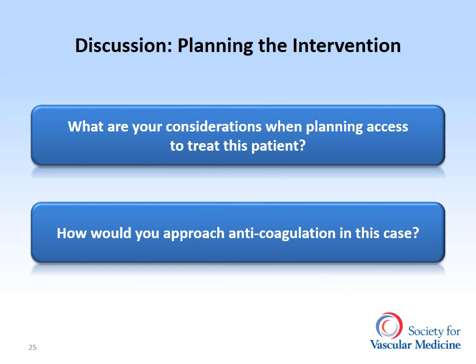There are a number of considerations regarding vascular access and anticoagulation for this patient. With respect to access, ipsilateral retrograde is one option that would provide good support. However, the short distance between the common femoral sheath entry site and CTO distal cap might risk loss of access during the procedure and could make stenting the distal external iliac artery difficult.